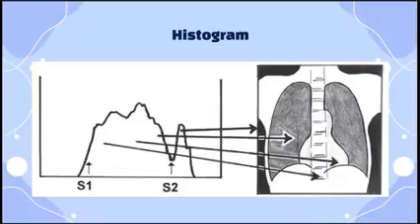For most applications, the computer must identify this tail portion, this area here, and eliminate it from the histogram analysis performed. Okay? If these pitch black background densities are included in the computer's calculations, the final image produced will be skewed away from the desired brightness and contrast level.